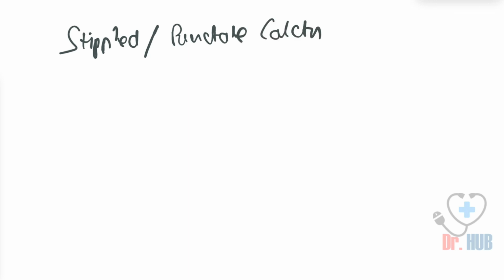Next we are going to look at the stippled or the punctate calcification. So what do you mean by the stippled or the punctate calcification? It is nothing but the chondroblastoma.